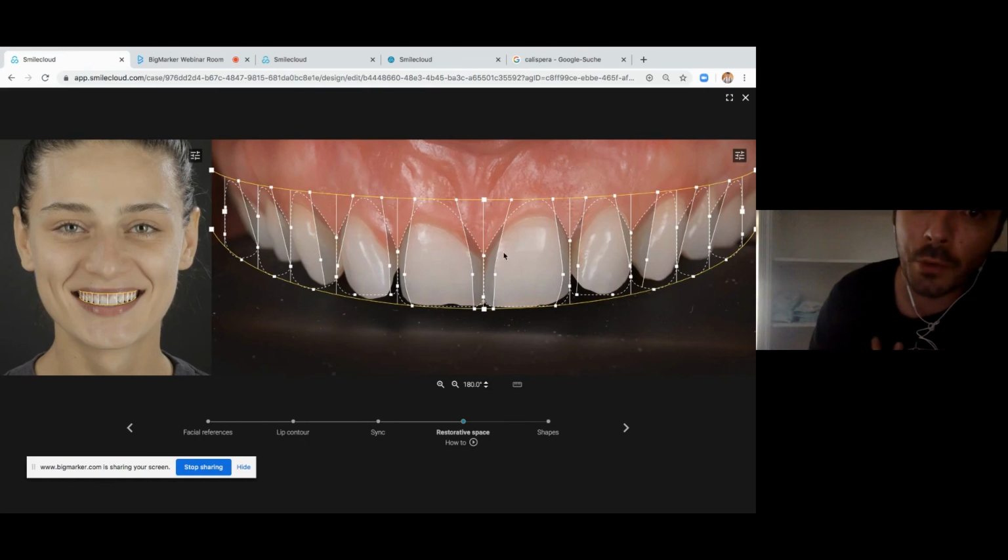Then you have the proportions, and then you have things like line angles, just like technicians would draw it with a pencil. Yeah, you can go in and do the same exercise now. And this will generate your search criteria.